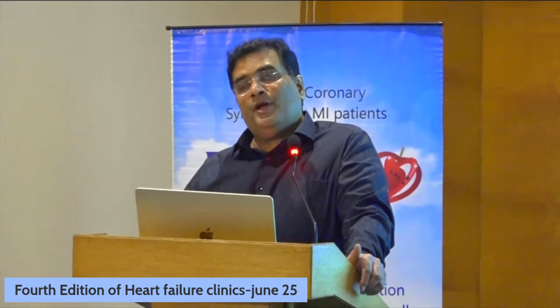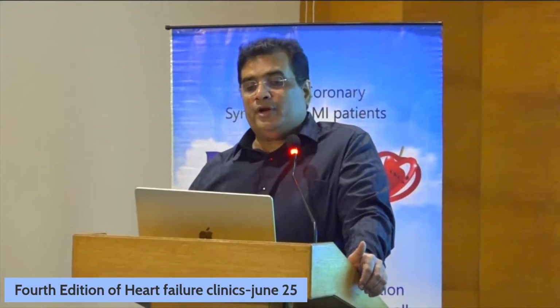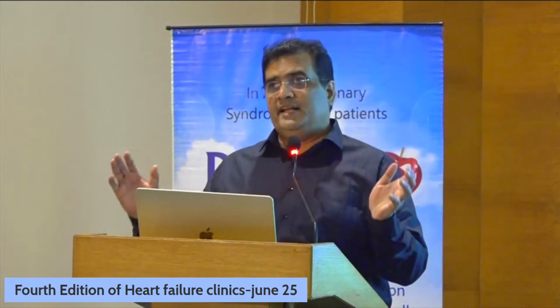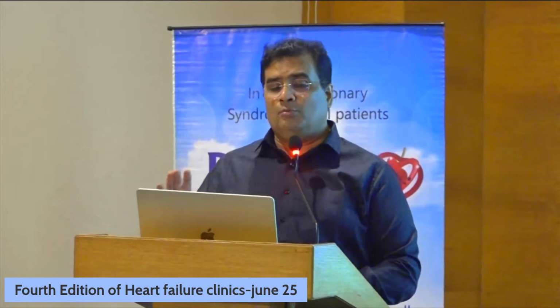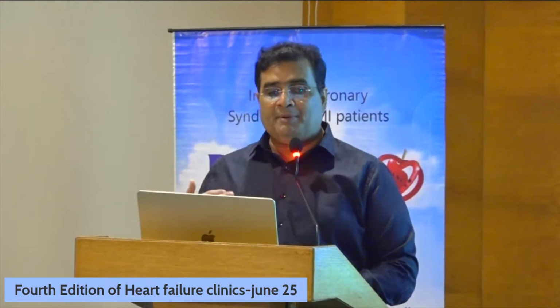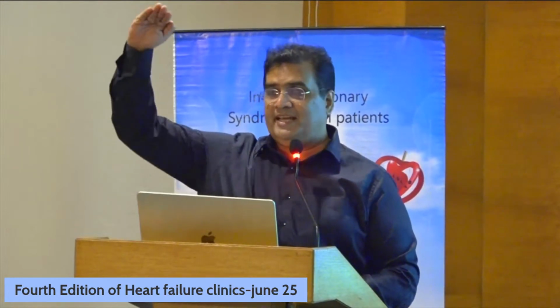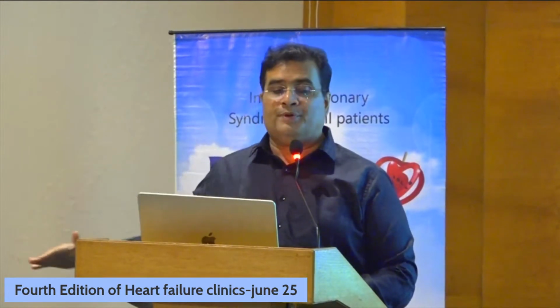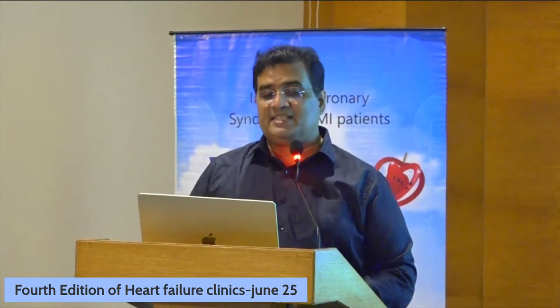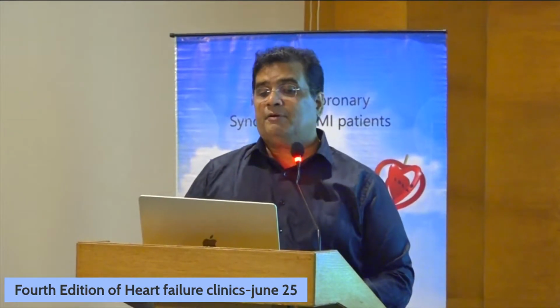And nowadays, we have physiology also integrated into the CT. That is what we call the CT FFR. In the West, CT plus CT FFR has almost replaced coronary angiography as a procedure. So in my practice also, in the last 5-6 months, my threshold to perform angiography is higher, and more and more patients are going for CT angiography because we know how to interpret them, we can understand it very fast, and we can get much more, sometimes better, detail for procedural planning.